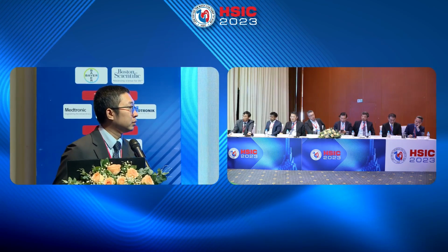Yes, actually you have very good collaterals from the right to the left side. So I think in case you fail to do the antegrade approach, we can go from the right side, go back to the ostium of the LAD with that technique. I think in this situation you did a very good job for this CTO. And you also recommended how to use the ping-pong technique as well. That's the learning point. Thank you.